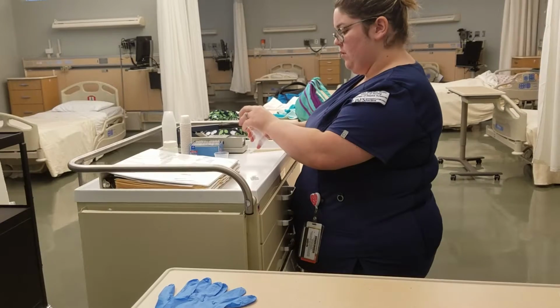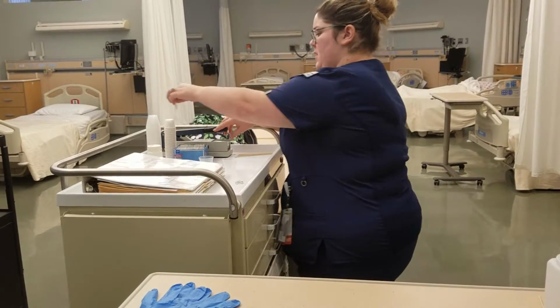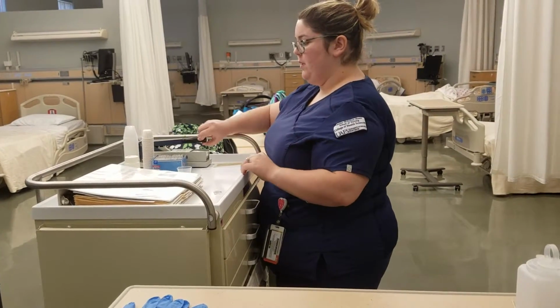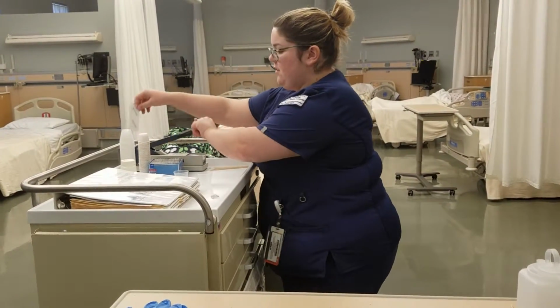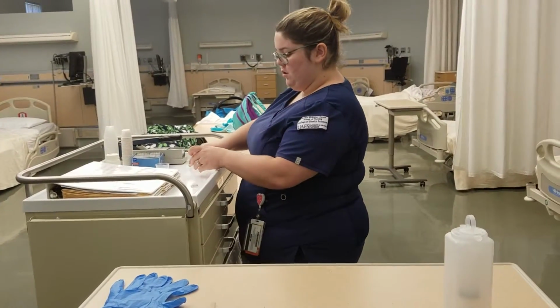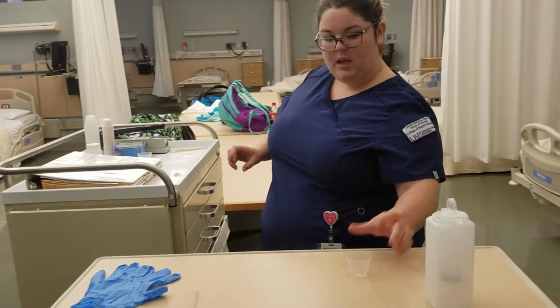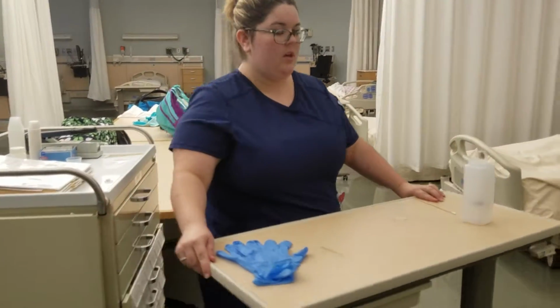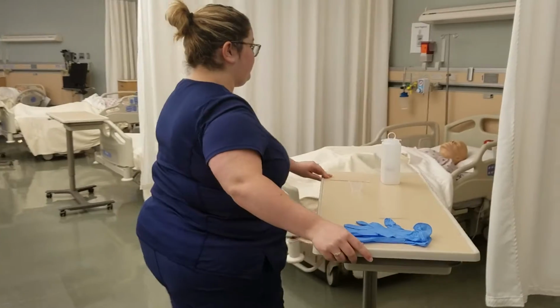I'm going to pour the medicine into my wrapper and I'm going to crush my medication because you want to make sure the pills are finely crushed so that they don't occlude the tube. I'm going to pour my medication back into the cup. I've got my water and my stir rod. I'm going to go to my patient's room.